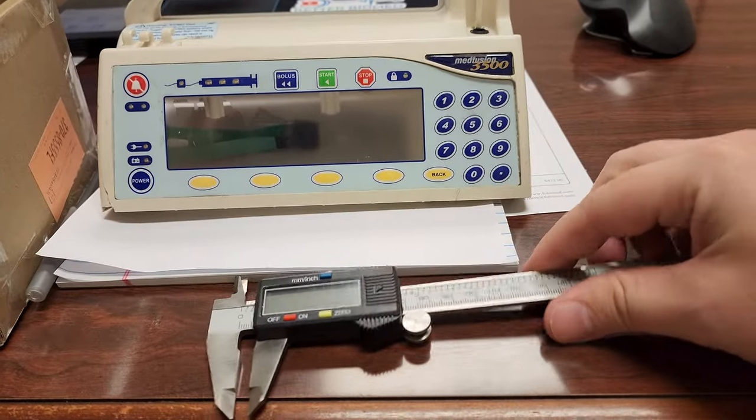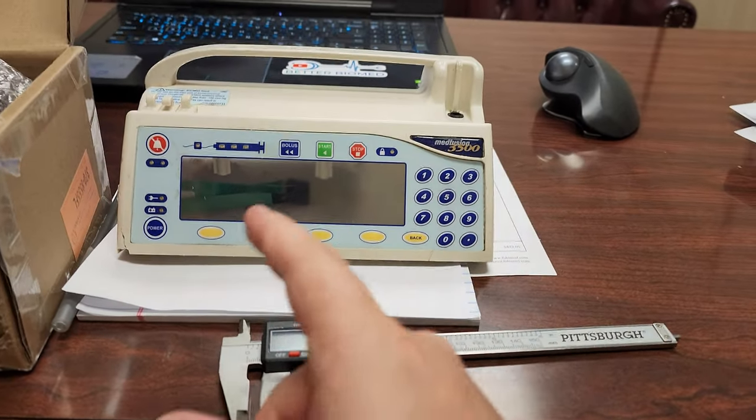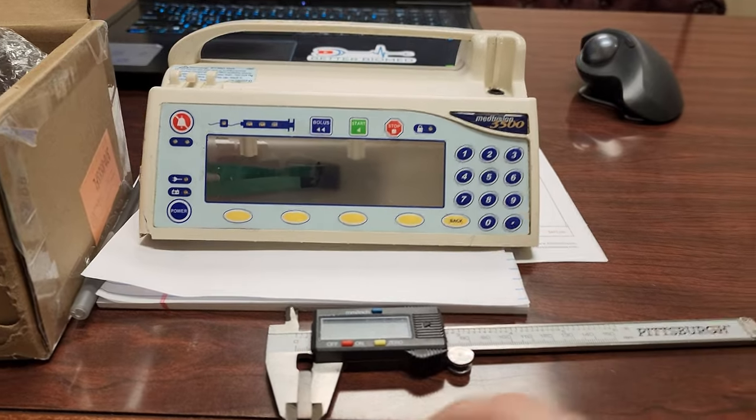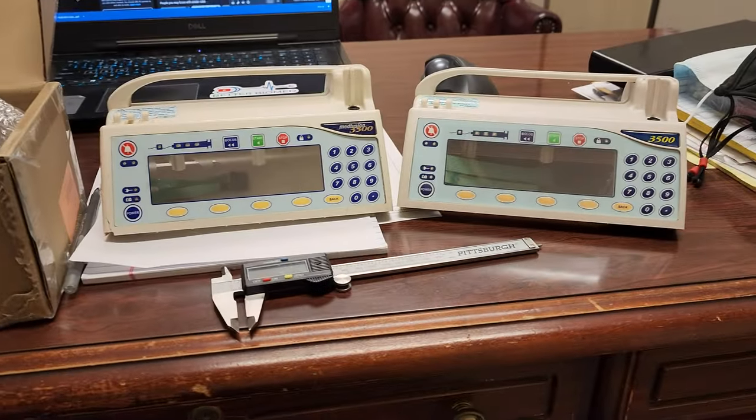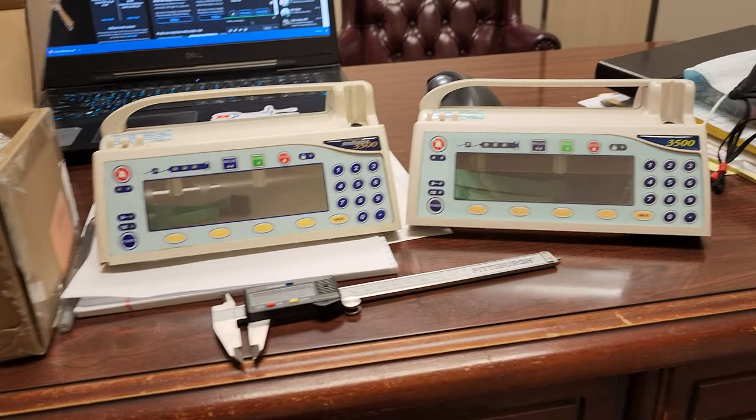I've even been using calipers to check thicknesses of plastic and stuff, just to be sure that it is an equivalent product. And let me assure you that this is an equivalent product.